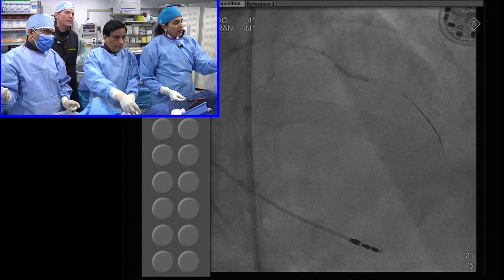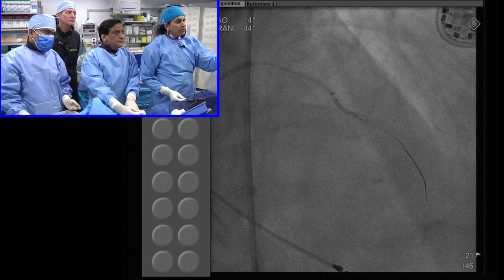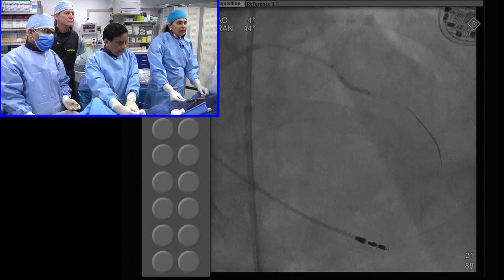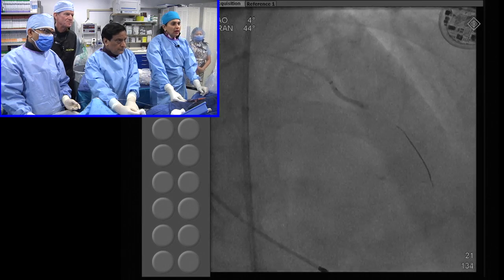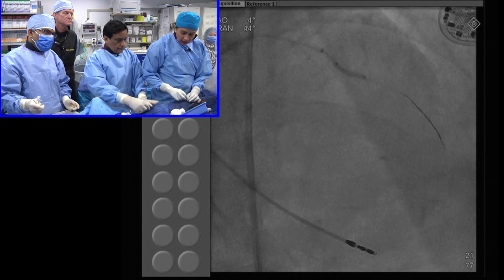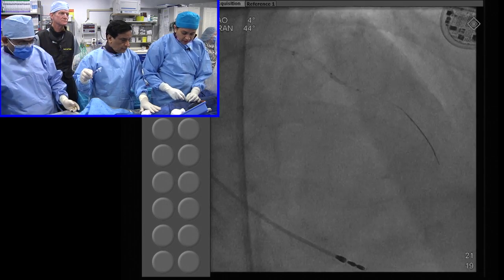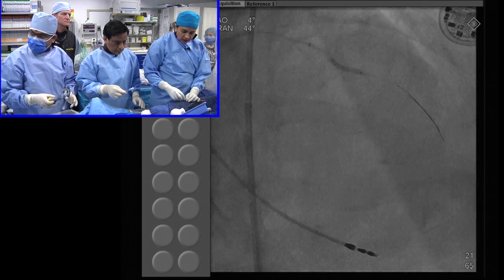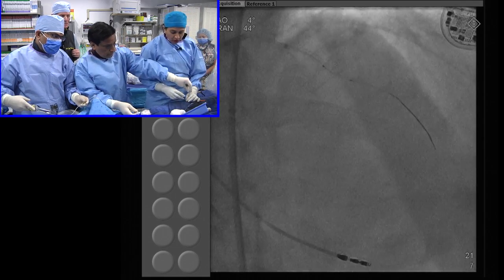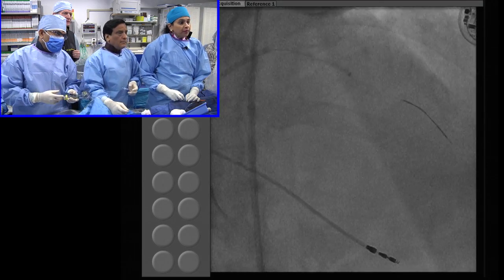Okay, if you see here, one of the important points is if you already have a proximal stent, how would you advance your guideliner? And if you see, this is where you go distal, very important, and once you dilate it, slowly over the balloon, you just advance the guideliner so that you are not disrupting the just placed stent. This is especially important if you are doing RCA. If for some reason the proximal RCA stent has been placed in a heavily calcific vessel, and now you have a distal edge dissection and nothing is going, you need a guideliner. This is what you do. You go distal, dilate, and the balloon has to be the same, 1 to 1. Don't go with a small balloon, everything will come out. The guideliner will not get sucked in. It's a really nice technique.